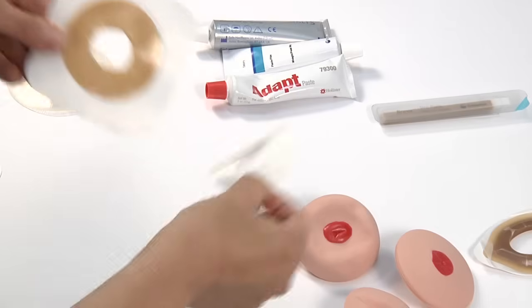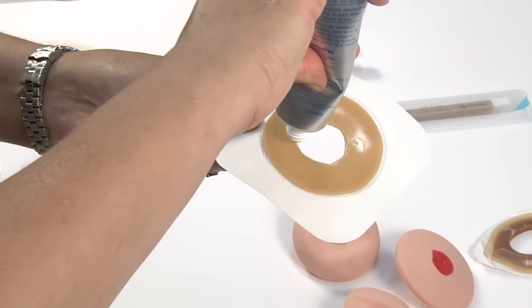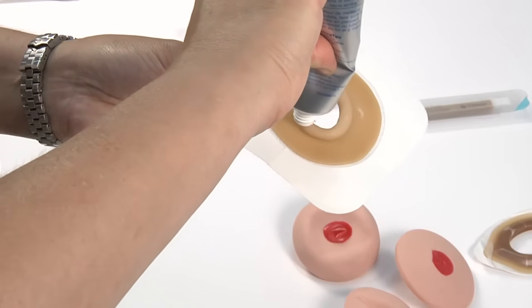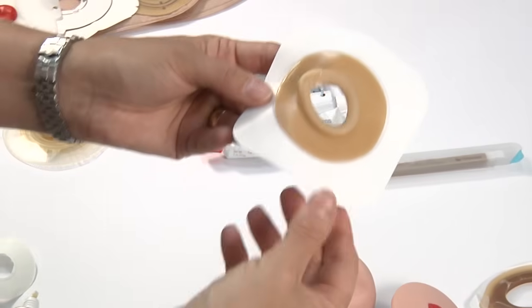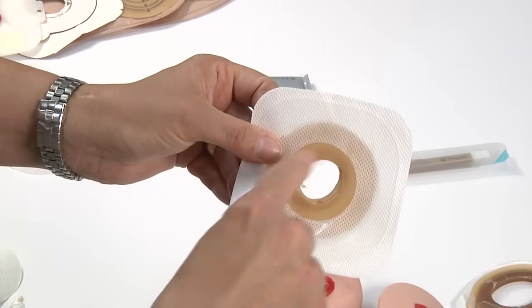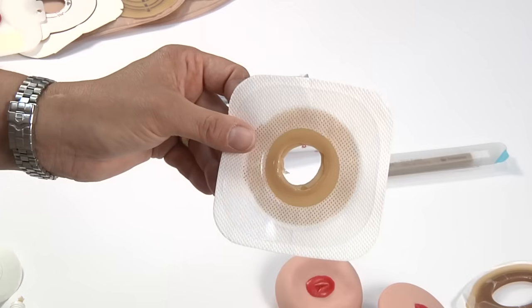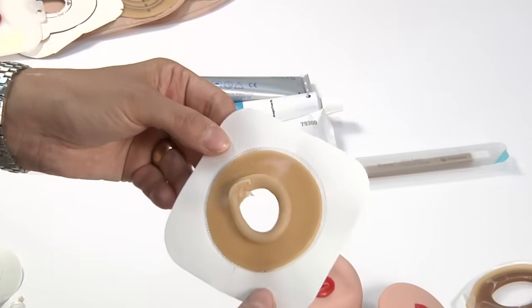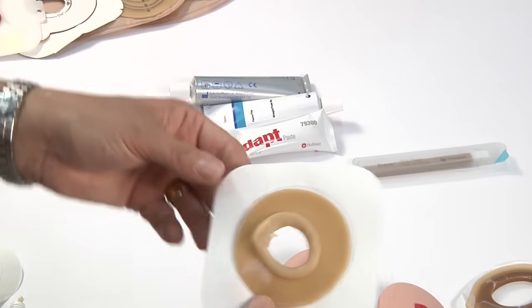So if you were going to apply that on the back of this, you would want to apply a very good bead of paste all the way around that opening like this. And once you've done that, you would then apply it over top, and you should actually see the paste bubble up over top of the stoma. And you don't want to wipe that away, you want to leave it in place because it's actually going to provide a good seal. Remembering that this is not actually glue, this is not adding adhesive onto the back, it's a filler or a caulking.